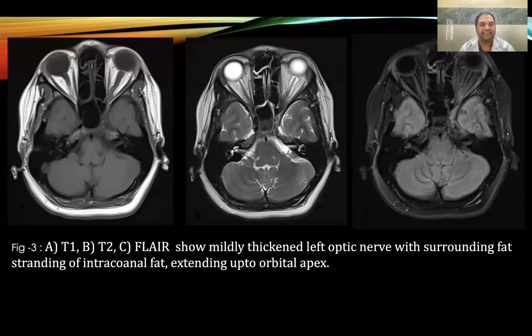Figure 3, A, B and C: These are T1, T2 and FLAIR axial images showing a mildly thickened left optic nerve with surrounding fat stranding of intraconal fat extending up to the orbital apex.